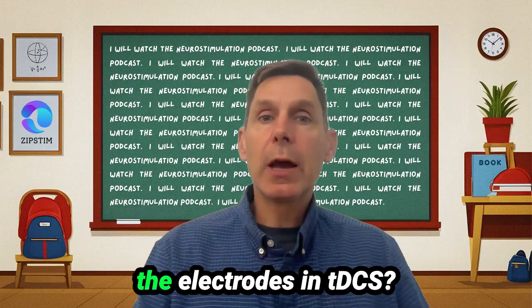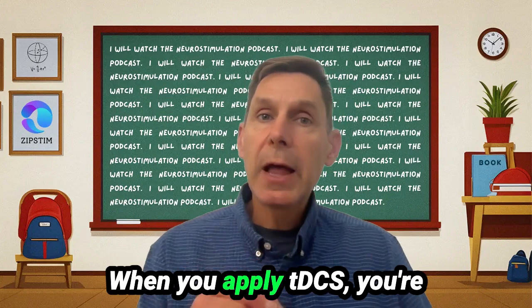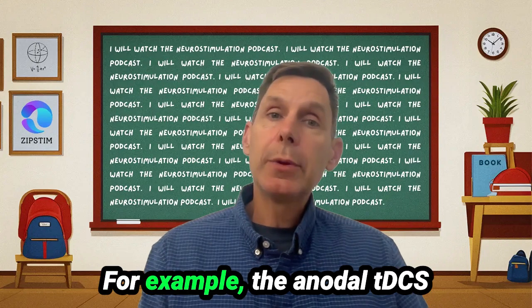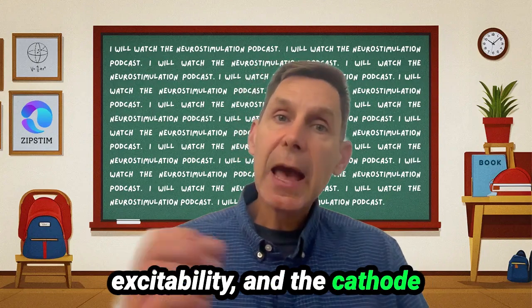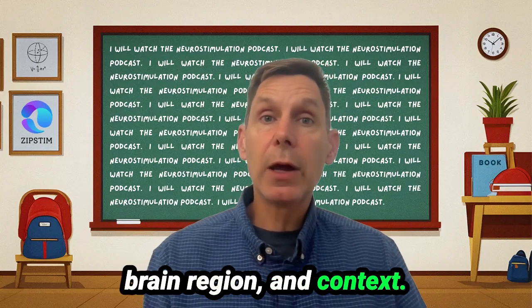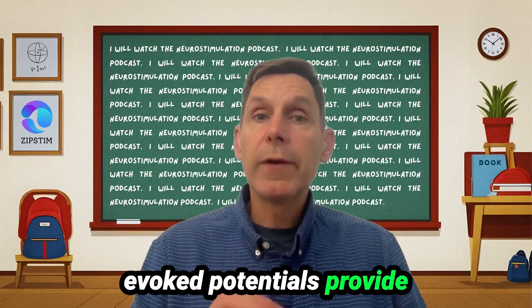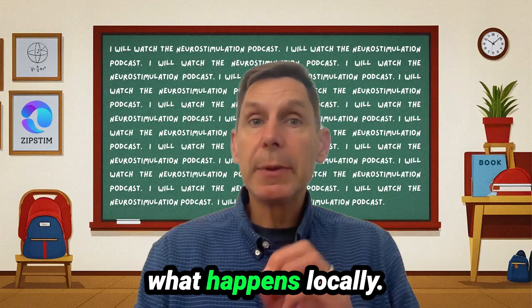So what happens under the electrodes in tDCS? Let's talk about regional effects. When you apply tDCS, you're modulating membrane polarization of the neurons directly under the electrodes. For example, anodal tDCS usually increases neuronal excitability, and cathodal tDCS often reduces it, although this varies by brain region and context. These effects have been most studied in the primary motor cortex, where changes in motor evoked potentials provide a relatively straightforward measure of cortical plasticity. But it's not just about what happens locally.